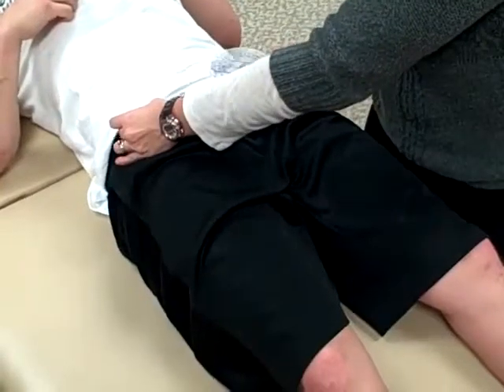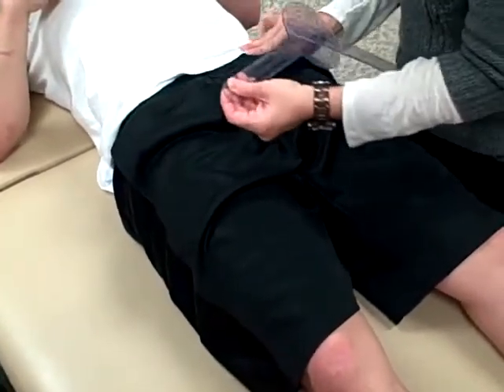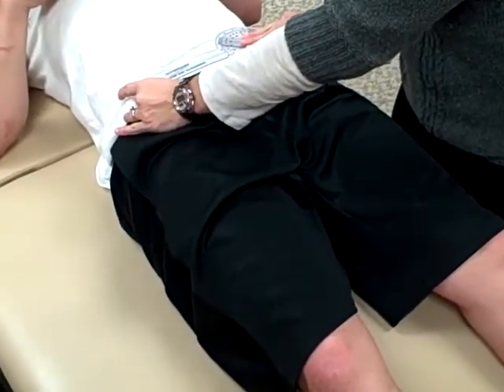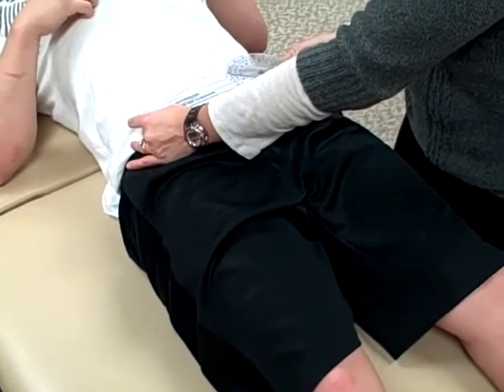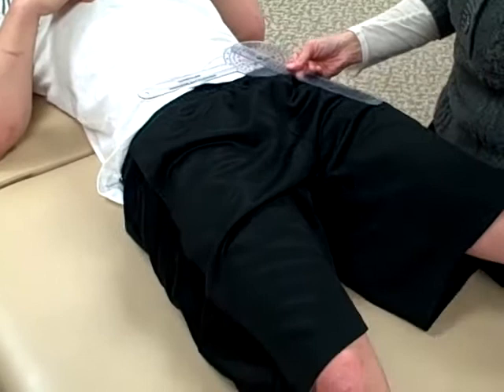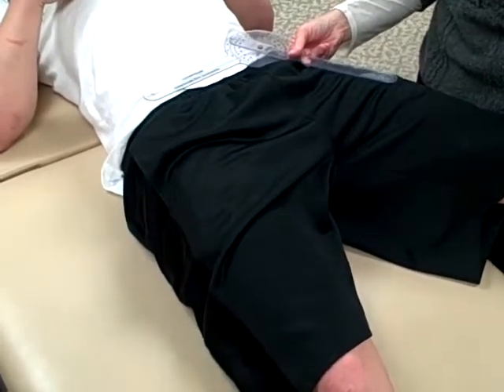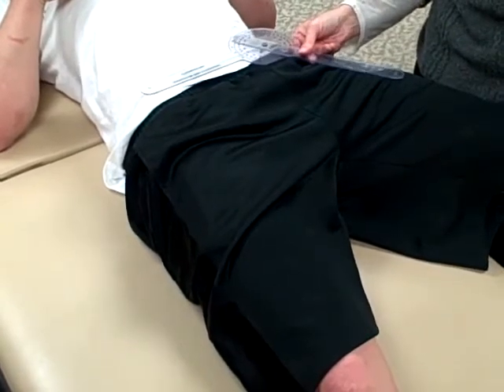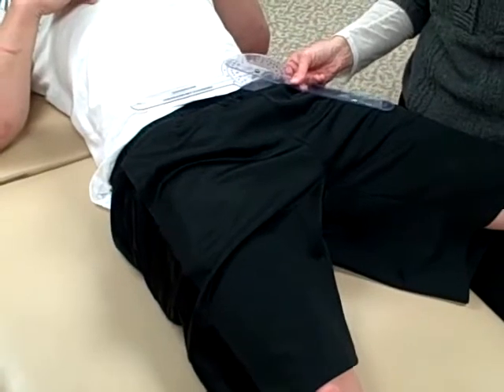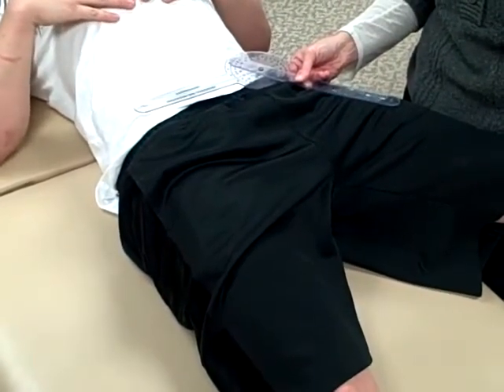Alright, for hip abduction, patient again supine, your axis is at the ASIS on the affected side. Your stationary arm is the line connecting the left and right ASIS. Your movable arm will be parallel with the long axis of the femur. You're going to read it from neutral, with the goniometer reading 90 degrees as your neutral position. You're going to passively abduct the hip to the limit of motion, and your normal range is from 0 to 45 or 50 degrees.